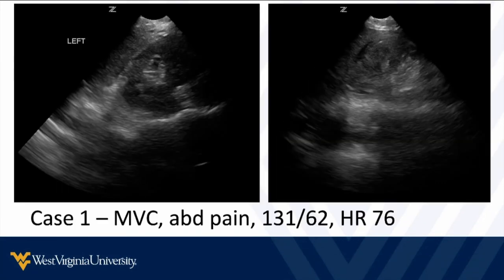And that brings us back to our first case where the patient had some abdominal pain but normal looking vital signs. Now, if we interrogate these images really finely, we probably see a little bit of irregularities here. Subtle, may be hard to call with just these images here. There's probably a little stripe of fluid, but subtle, may be hard to see.